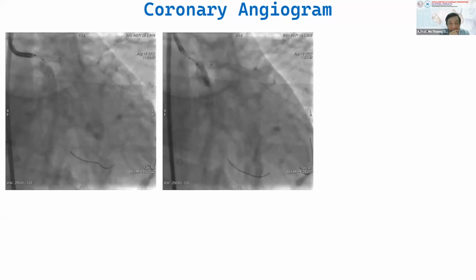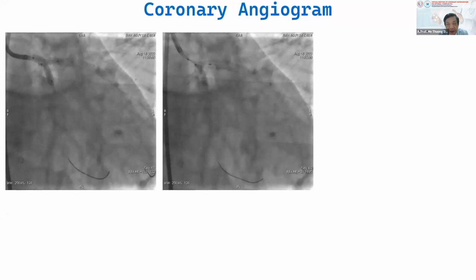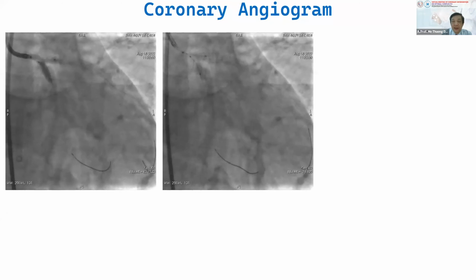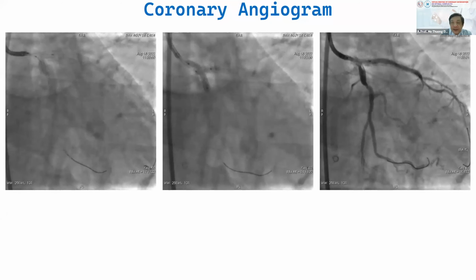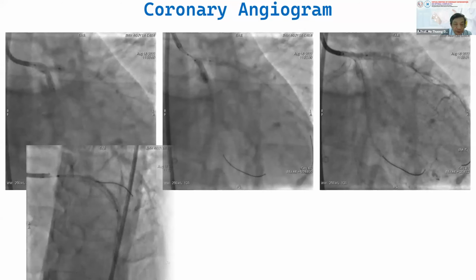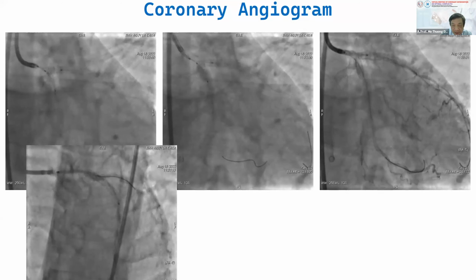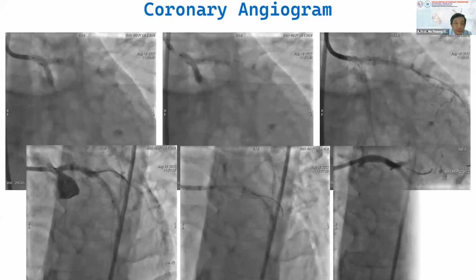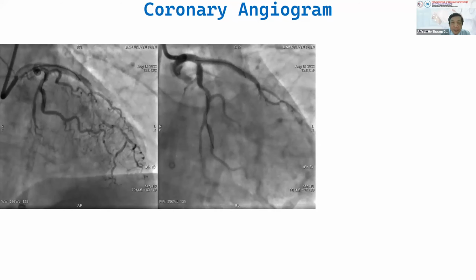So I choose the two-stent technique, with one stent in the ostium and proximal segment of the circumflex and one stent from the left main to the proximal segment of the LAD. Stenting the circumflex, and we prepare the stenting from left main to the LAD proximal segment. That is the last result. We do optimization, we do the final kissing balloon.